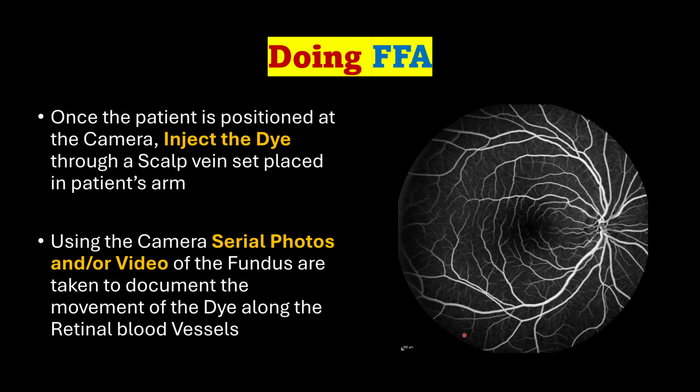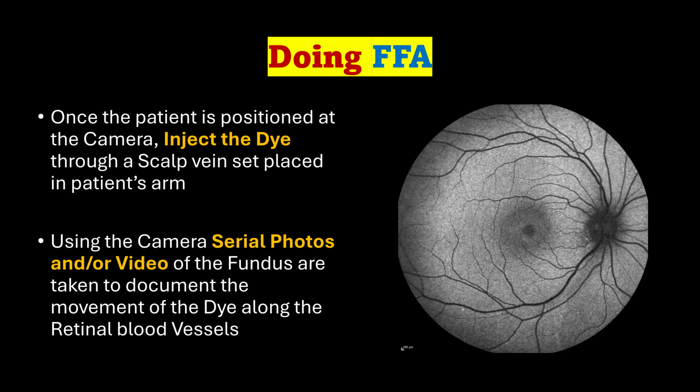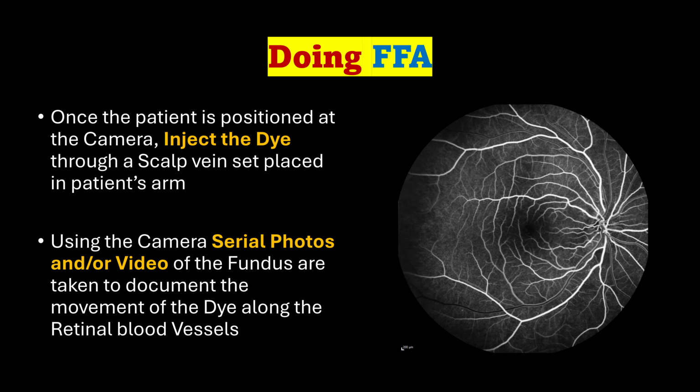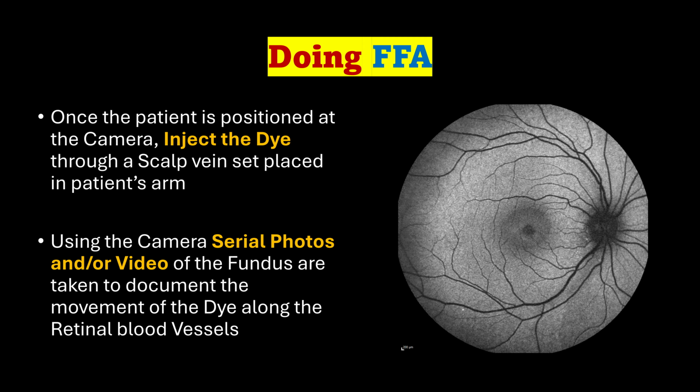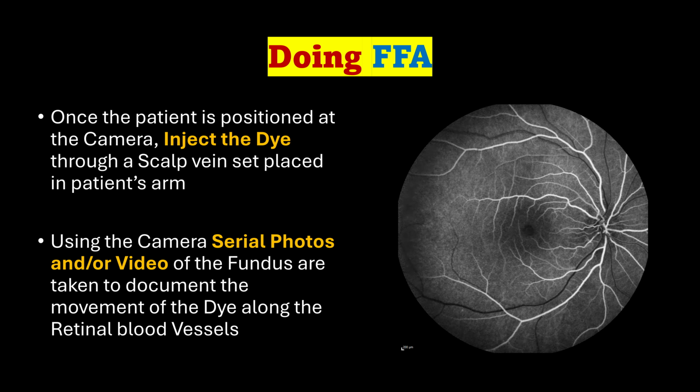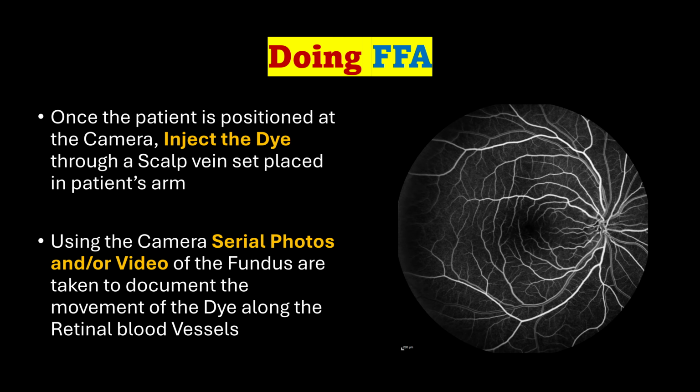Here is a video, for example, where we can see how the dye is moving through the blood vessels. In Heidelberg, we have this facility to record the whole movement of the dye, and this definitely is a very interesting feature.